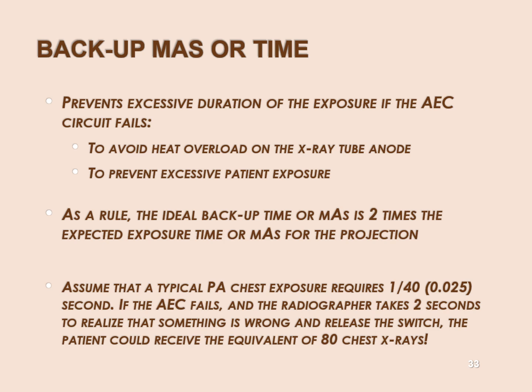Okay, backup time, it's always appropriate to have a backup time in your AEC software because sometimes you never achieve threshold ionization. If the body part is too thick, then you're never stacking ions in the chamber or in the ballast capacitor, right? Because your remnant beam's so thin that nothing's getting to the ion chamber, okay?